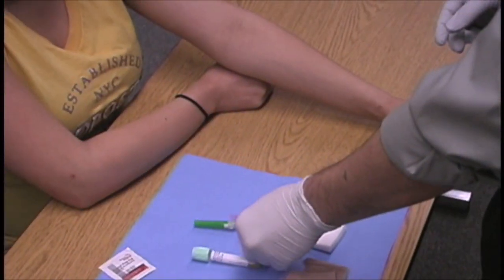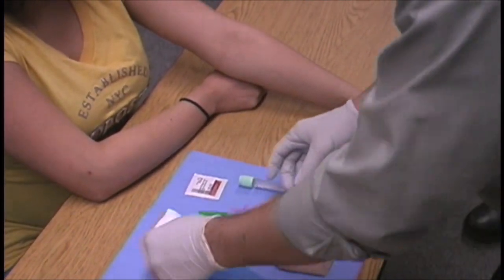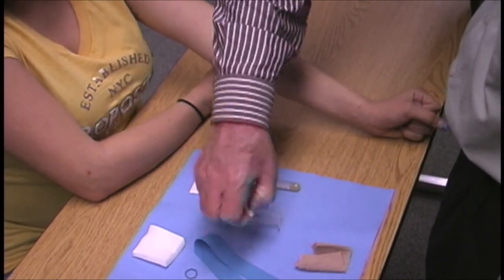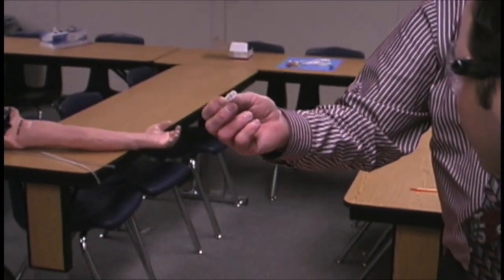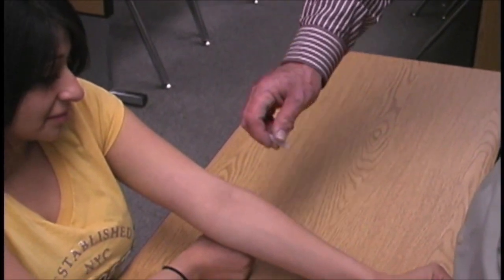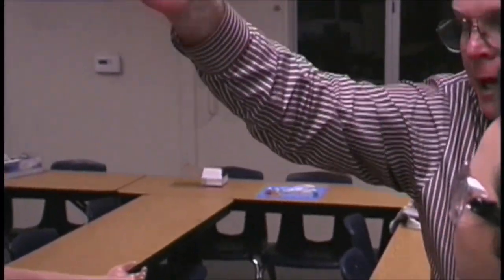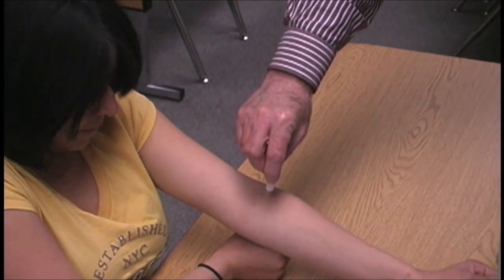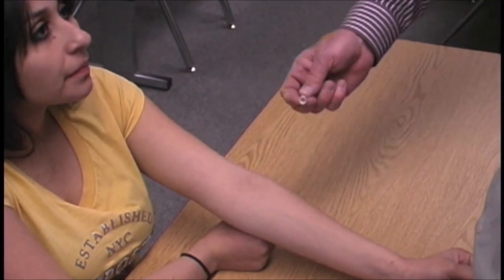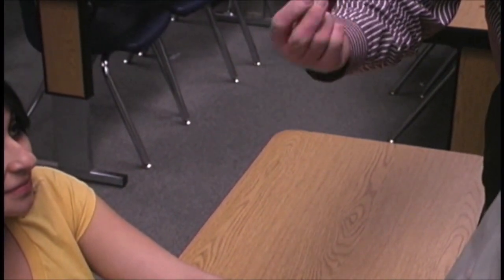He lays it down on his setup and gets everything in order. Notice this little holder or cap — a lot of people would think it's just trash, but it can be used as a marker. If you cannot see the vein after the tourniquet is placed and after you palpate, you can take this cap, gently lay it over the vein with a little pressure, and it leaves a round circle over the top of the vein. You can then direct your needle right into the center of that circle.